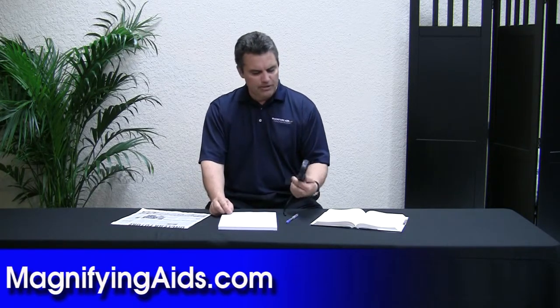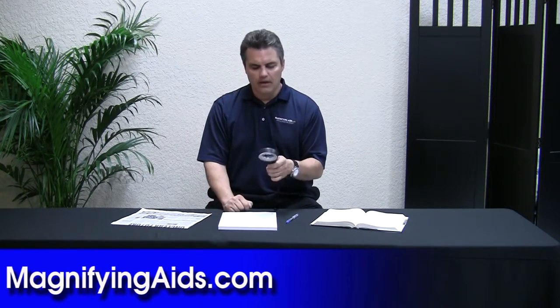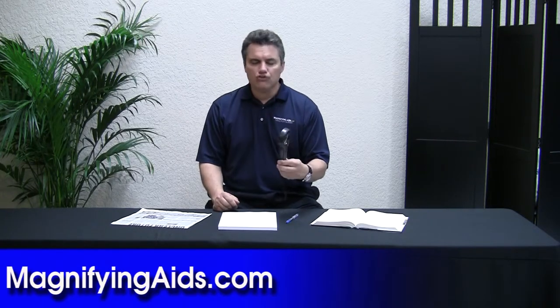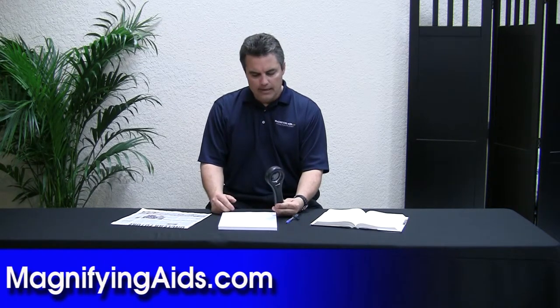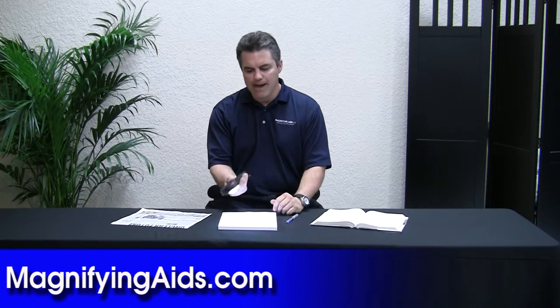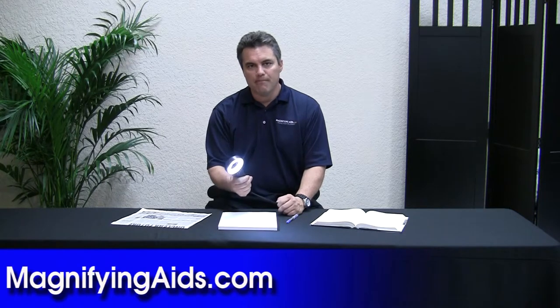This is a pretty unique item because it has 24 LED bulbs underneath, and it takes four AAA batteries to light this up. The unique thing about LED, which is light-emitting diodes, is that you can leave this on for two days and it's not going to drain your battery. So LED is really the preferred type of light source when it comes to magnification.